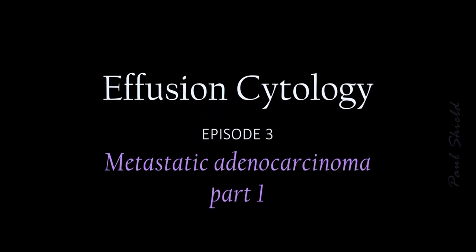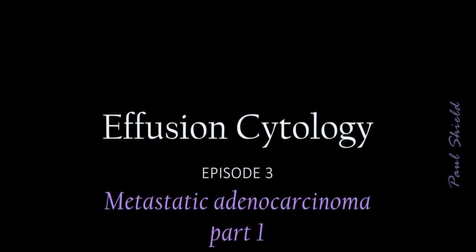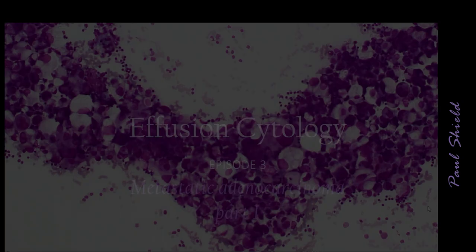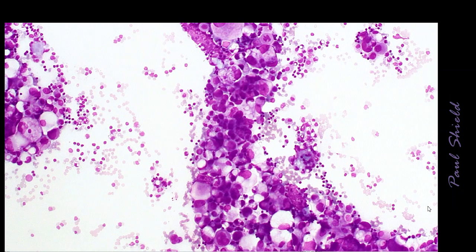Hi, it's Paul. In this clip I want to look at the most common presentation of adenocarcinomas in serous effusion specimens. So these are probably the samples that show the classic adenocarcinoma features, and they're quite nice to look at. This is a classic example, an ovarian adenocarcinoma in ascites.